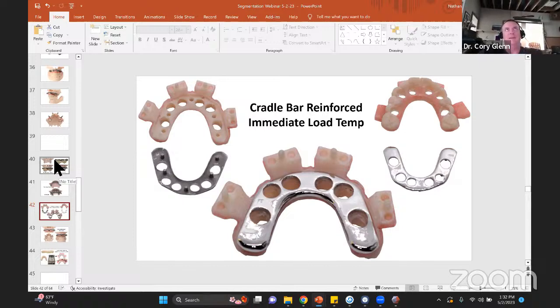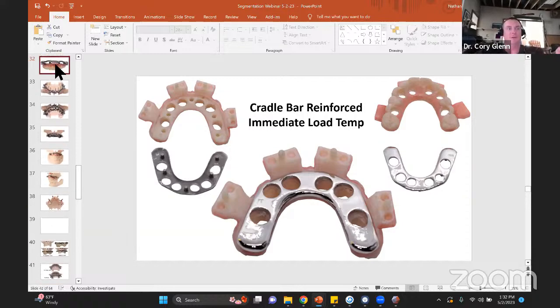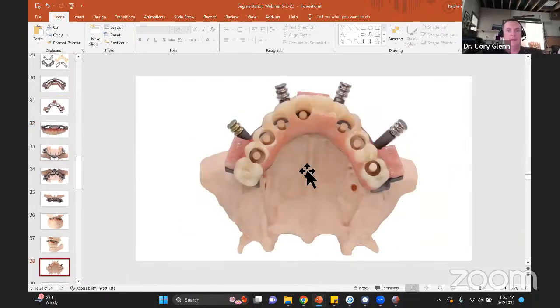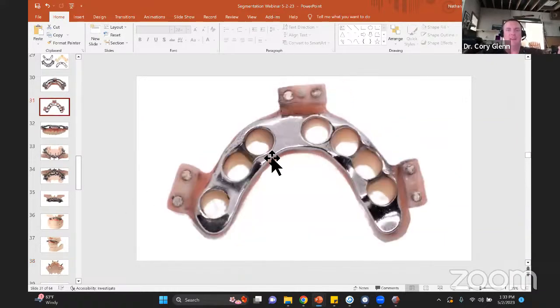And it doesn't do as well once you start punching these big pickup holes in it, right? So if you were to look at here, once you have punched these big pickup holes in it, you're left with really just a small, thin area of that Trilor still intact and a lot fewer fiberglass fibers to hold its integrity. So, I mean, bottom line is, yes, you can do it, but it's going to be much, much weaker than this. And it's a lot less lab work.